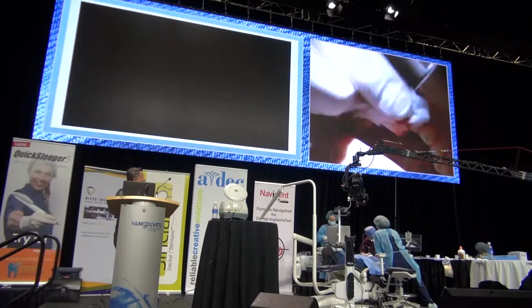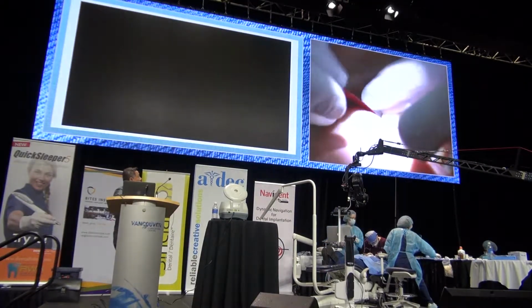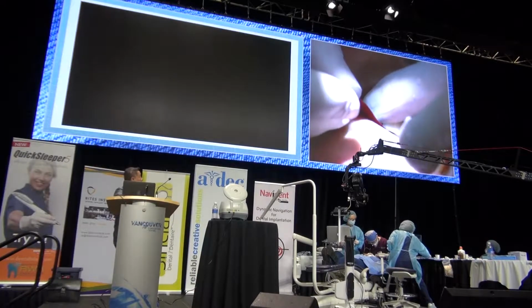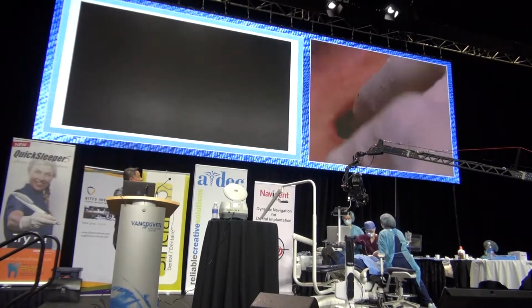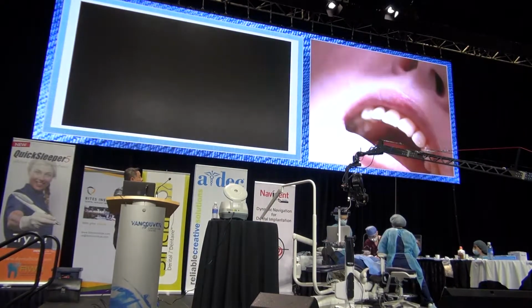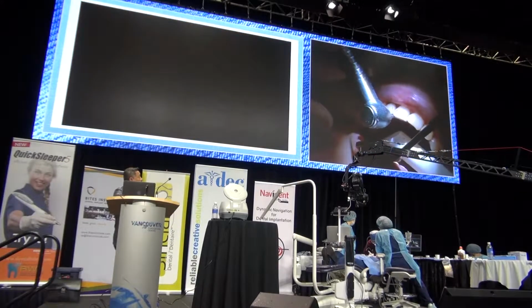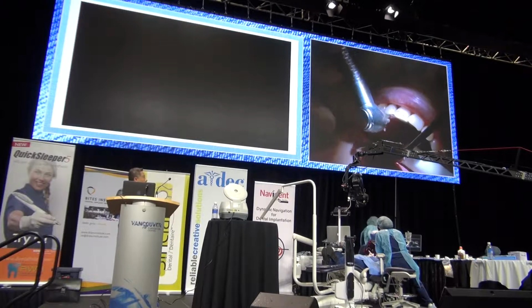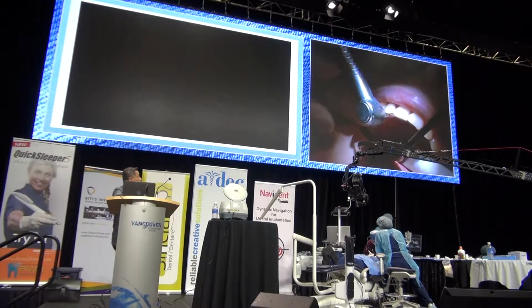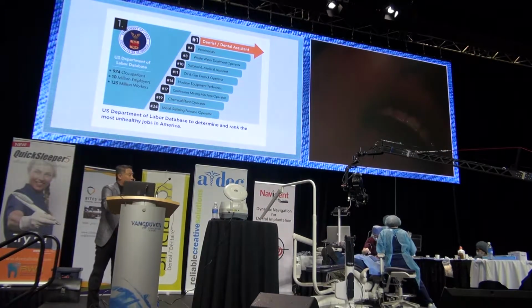Now he's inserted the screw retained provisional. Checking the occlusion, both in MIP and excursive movements, and you do need to reduce the occlusion to make sure there's no contact, zero contacts in terms of MIP or excursive movements on this crown. So again, this is meant for aesthetics, phonetics. It is not meant for mastication. And the patient needs to be compliant to this.